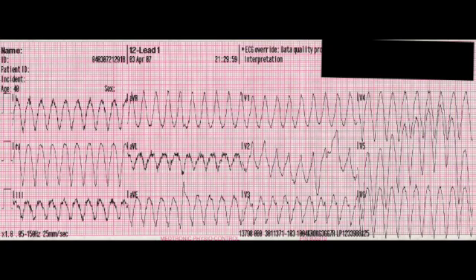Well, to me, I don't care. Let me be really clear with this. I don't care. This is a patient with chest pain and hypotension with a rapid, regular, wide complex tach. It doesn't matter what I name it, right?